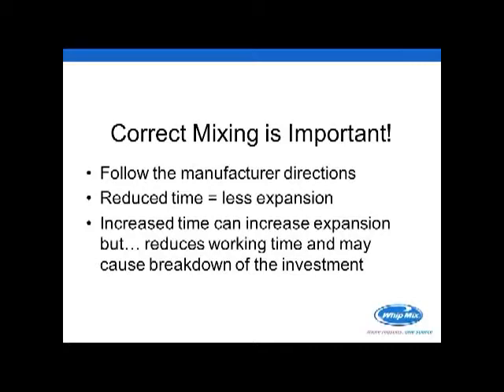Remember, as you're mixing things, you're also adding friction, temperature and energy to this mix. And those factors have all been balanced by our chemists here at Whipmix so that you can have a good, consistent mix if you follow the instructions. Now, if you deviate from those, then you really need to talk to somebody in technical support here so that we can talk about problems that might arise by deviation. Or if you're not getting the results that you need, then you need to talk to us also, and let's see if we can correct some of that.